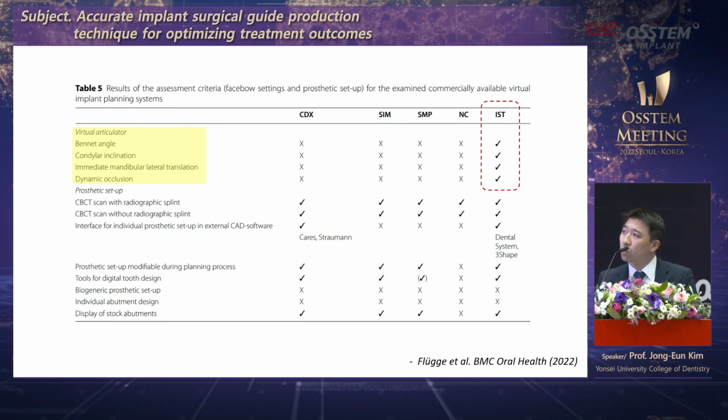What I really like about this is that in diagnostic stage, you can use a virtual articulator here. So you can get dynamic occlusion information and do digital wax up ahead. It's a huge benefit. So you can provide customized treatment.